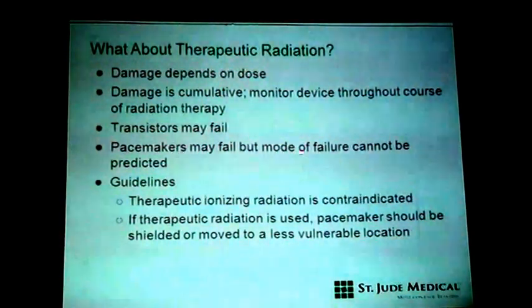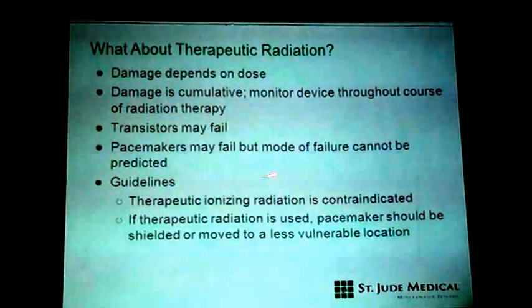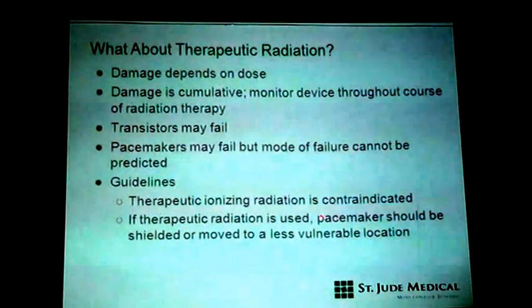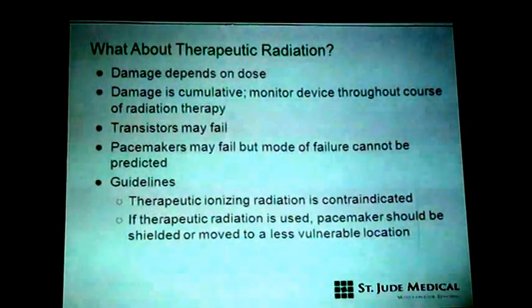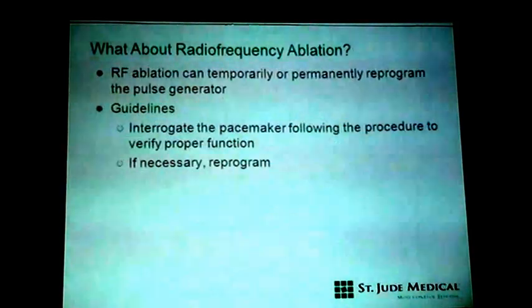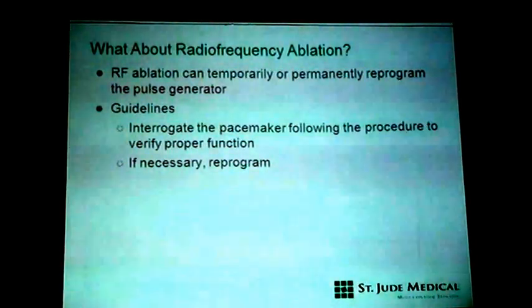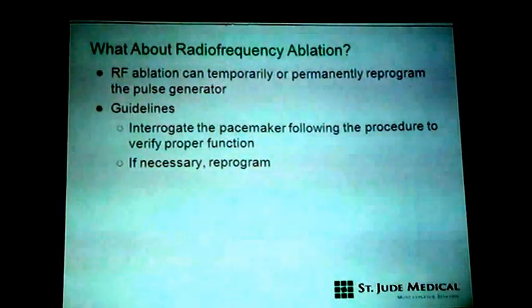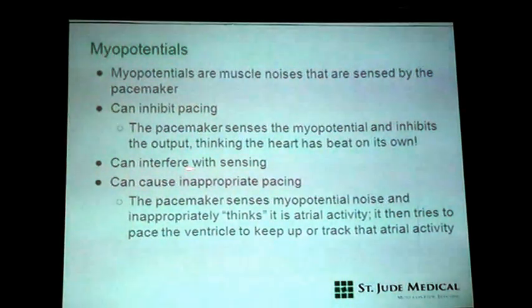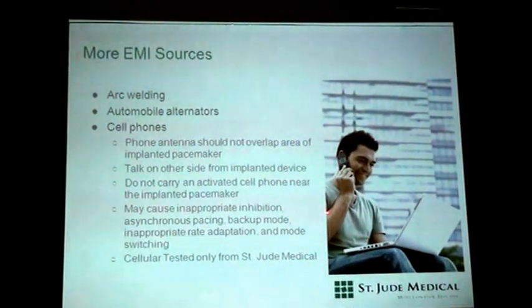Regarding radiotherapy radiations, it can damage the functioning of the pacemaker, but we cannot predict it for a pacemaker patient who goes for that. Generally, it is contraindicated. If it is used, it should be much away from the site. So these are the 5-6 conditions we are getting in our hospital also, in various ways. For ablation, we have to be very cautious. And regarding the mobile phone, it is very controversial.